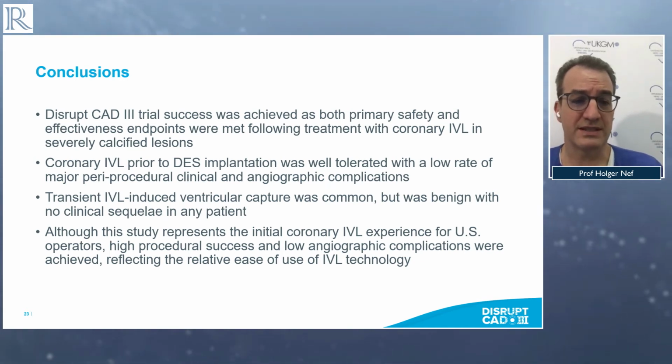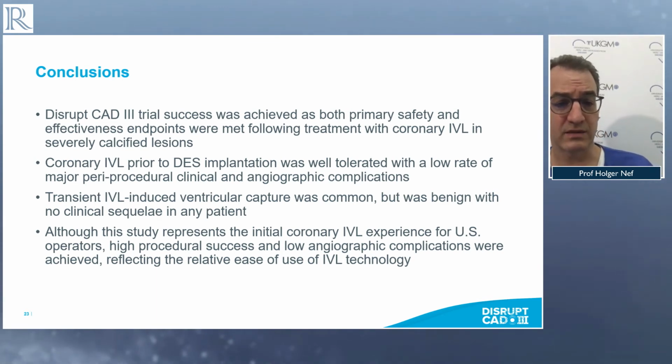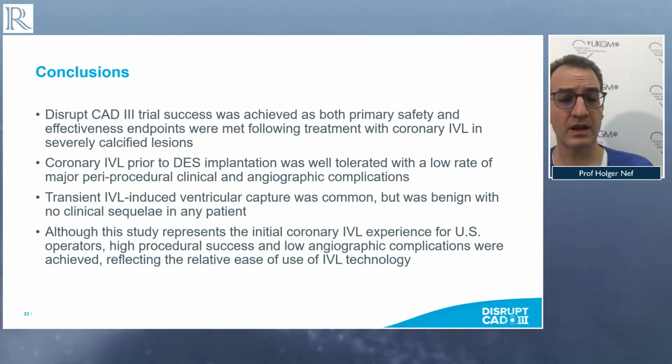And there was a transient IVL-induced ventricular capture, of course, but this was benign with no clinical sequelae in any patient. Although this study represents the initial coronary IVL experience for US operators, high procedural success and low angiographic complications were achieved, reflecting the relative ease of use of IVL technology.